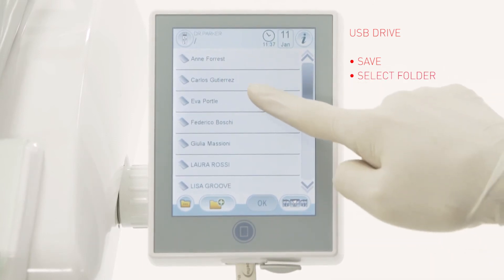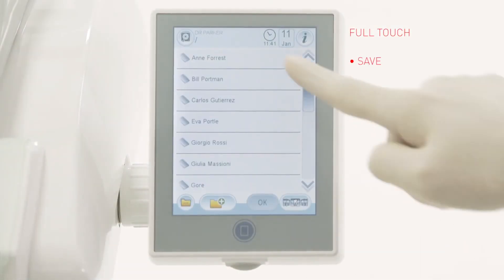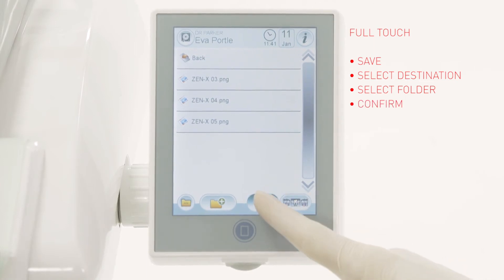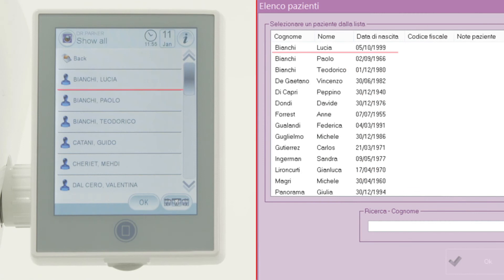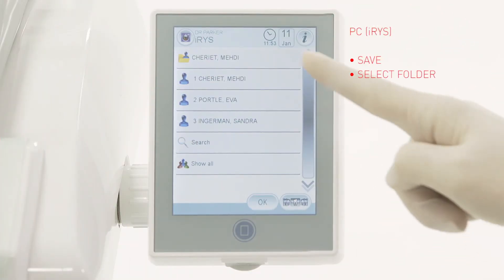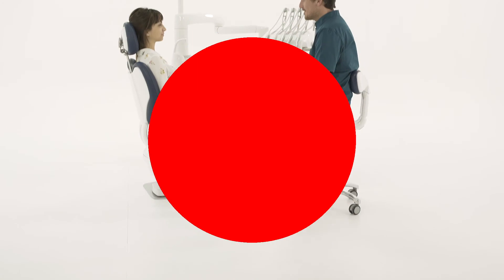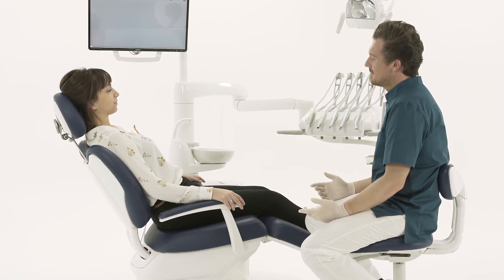To save to a USB flash drive: select folder and confirm. To save to local memory on full touch: select destination, select folder, and confirm. To save to a PC via iris software: the same list appears on full touch and PC — select folder, check personal records and confirm. The dentist is only required to act on the full touch control panel, without interrupting the workflow and without having to move away from the chair.